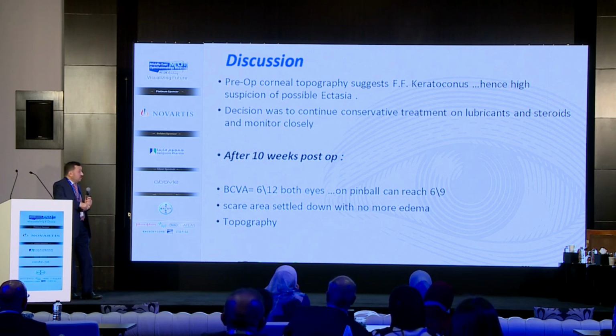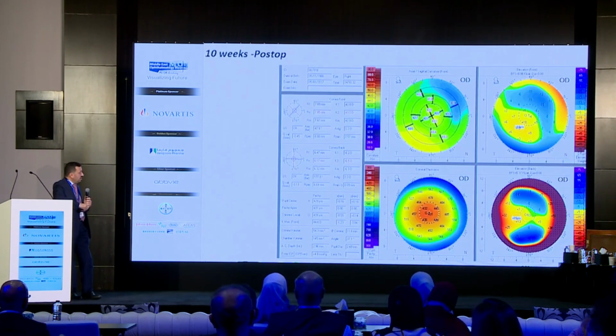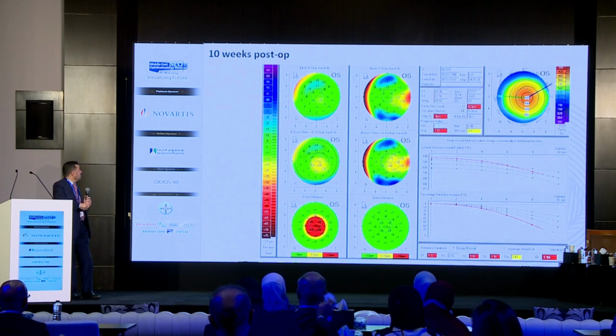After 10 weeks, after 2.5 months, the vision improved slightly, but with pinhole it reached 6/9. That was a good sign. The scar area settled down, of course, with the steroids. The edema resolved, for sure. And if we look at the topography, it has not changed that much, to be honest. We still do not have clear signs of ectasia in this case.